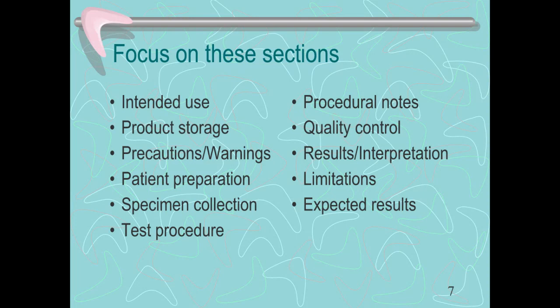So you want to be sure that it is stored appropriately. Look at the precautions and warnings. If the reagent has to be refrigerated once it's opened, put it in a refrigerated setting. If it says it must be protected from light, make sure that you put it in some kind of dark colored Ziploc bag. Be sure you follow that.